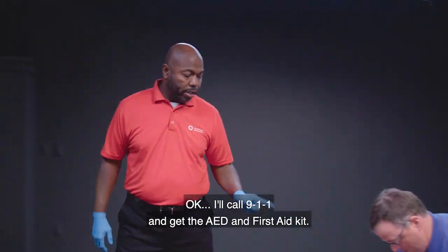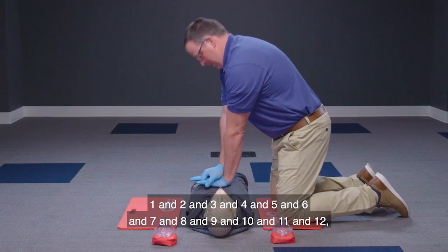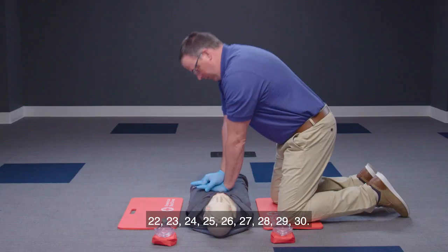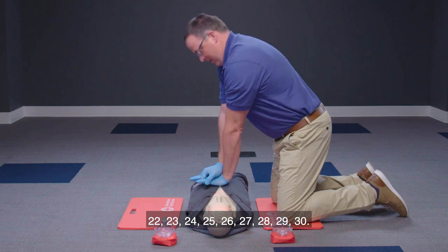The first responder begins CPR, performing 30 chest compressions while the second responder goes to call for help and retrieve the AED.